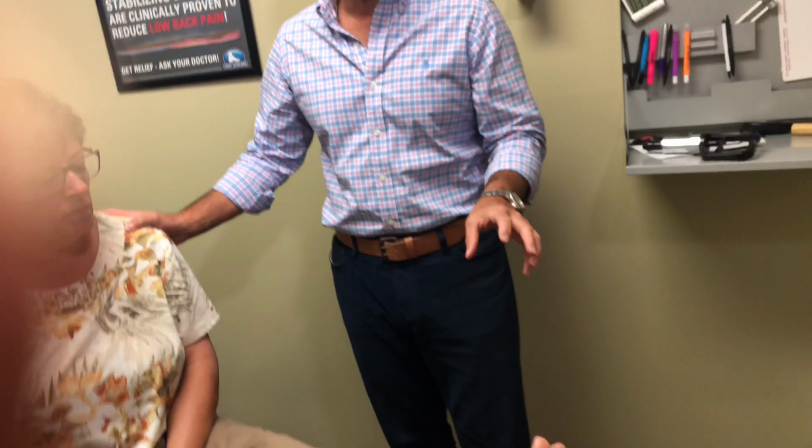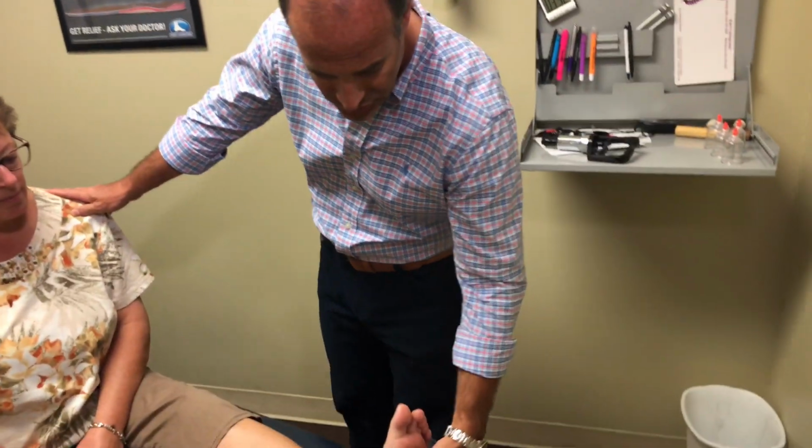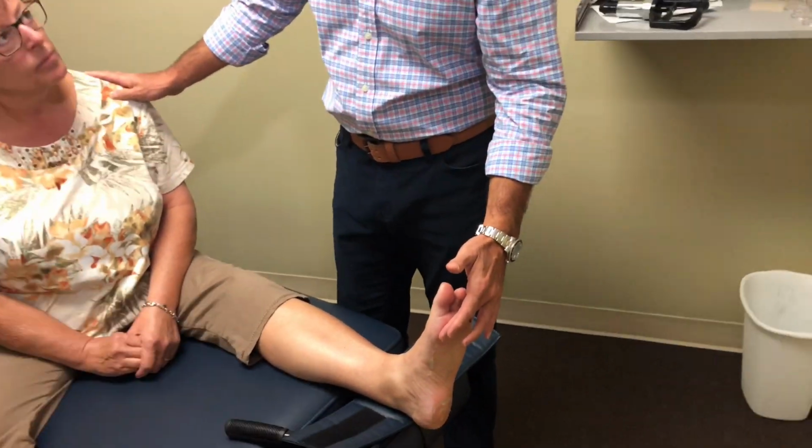All right, so look, I'm gonna show you how we treat this. Last week you saw we treated somebody with dry needling. That's not what we're doing to Ramona. With Ramona, we're doing 3 different things. We already had her on electrical stimulation, which we use to relax this tight tissue down here and reduce some of the inflammation.